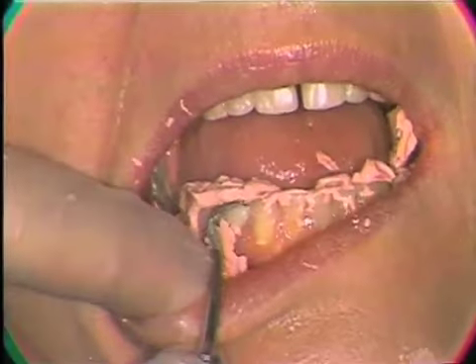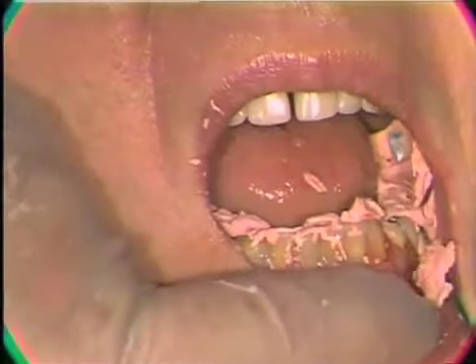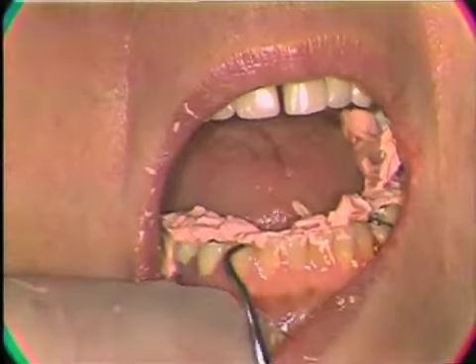Now the abutment teeth we have loosened up so that they would come off with the impression, so there's no problem getting it out of the undercuts on the abutment teeth. So as we free the impression, the material, or the tray and the impression material should come out of the mouth.